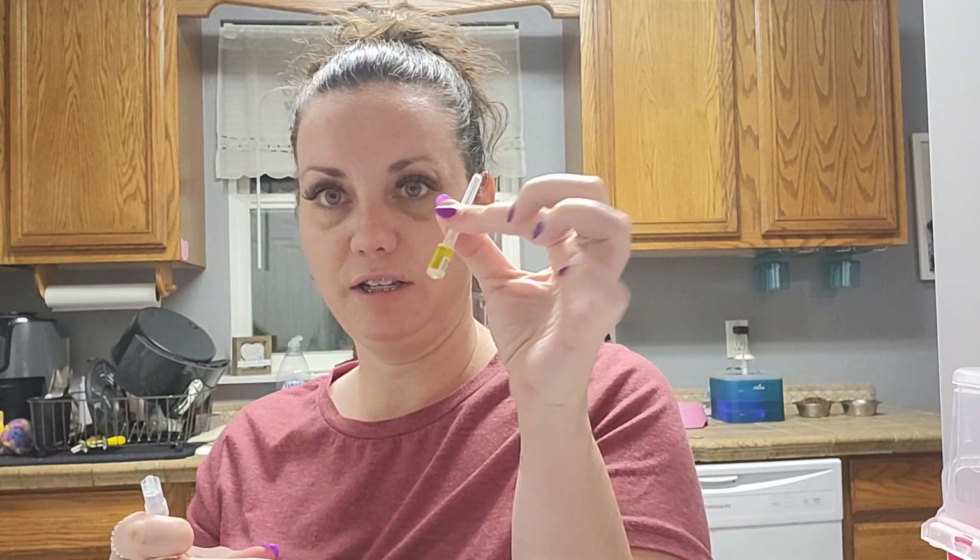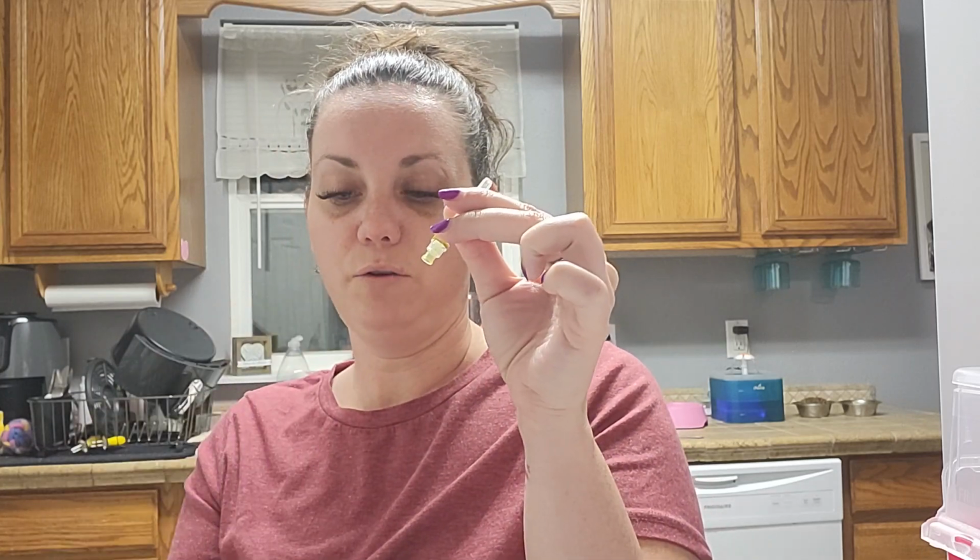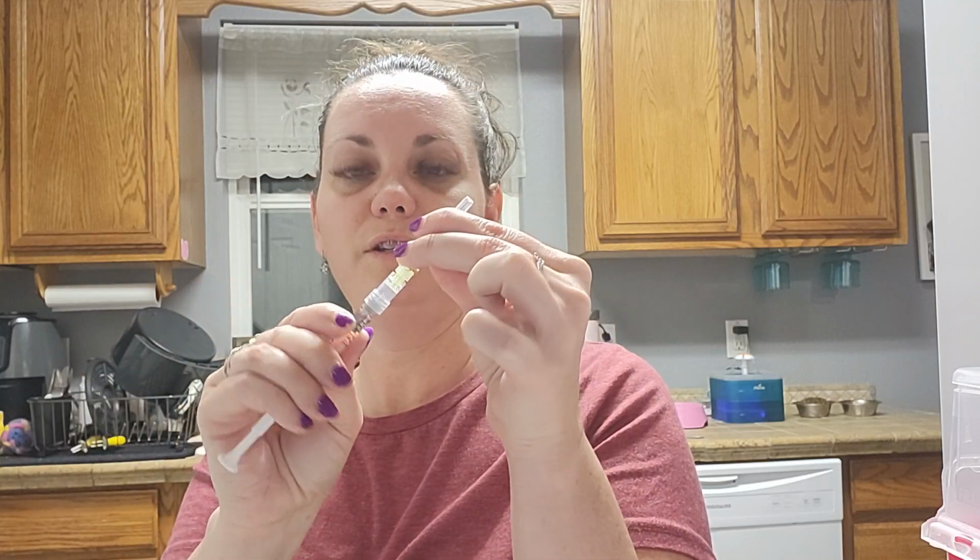Okay, so what we're going to want to do is, I washed my hands already, and I'm going to take this cap off of the pre-filled syringe, which is the diluent. It just untwists. And then it comes with 2 needles, and it'll tell you in the instructions. This one is probably a 21. Oh, it's a 20. So it's a 20 gauge, and it's got a yellow hub. We're going to want to untwist the bottom of it, just like so, and then twist it onto the syringe.